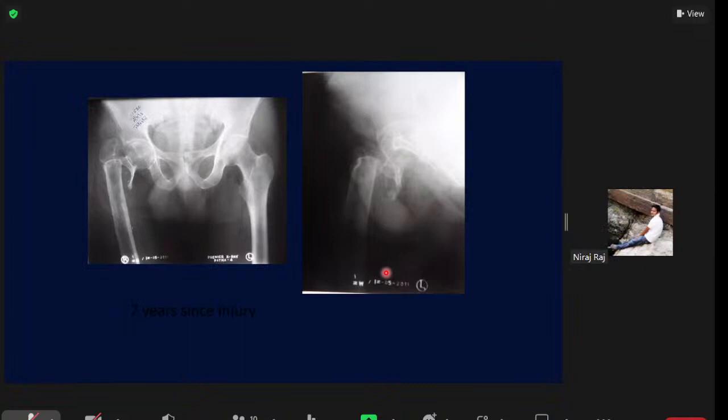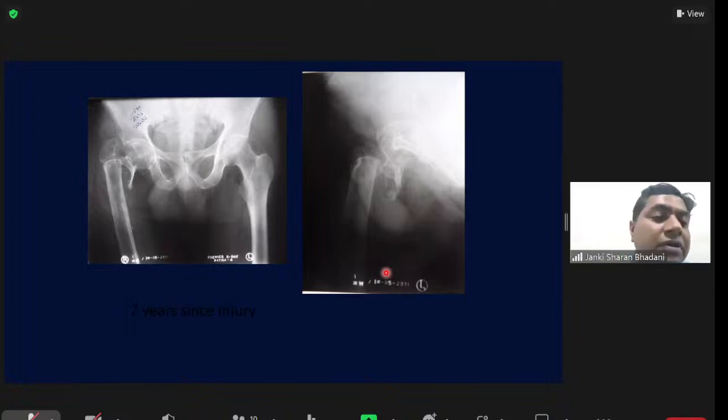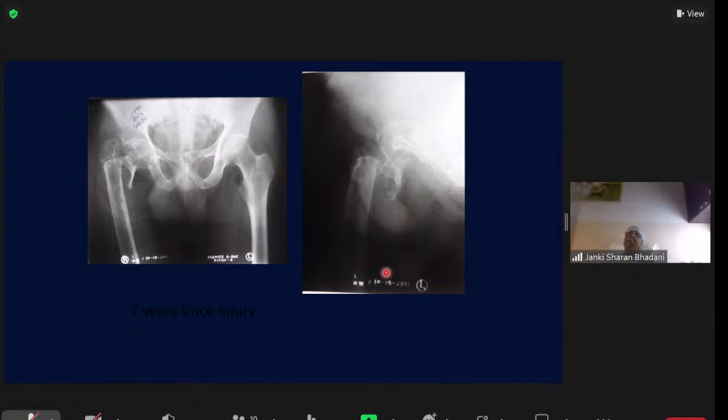Yes, sir. Because the proximal fragment, the medial part of the proximal femur, that beak, sir, is medial beak. It is quite long. Yeah, so that is another problem. I think you can call it Kyle variant, sir. Kyle variant is a fracture going into the neck. This is originally a fracture of the trochanter with the problem after fixation. And the trochanter also is off.